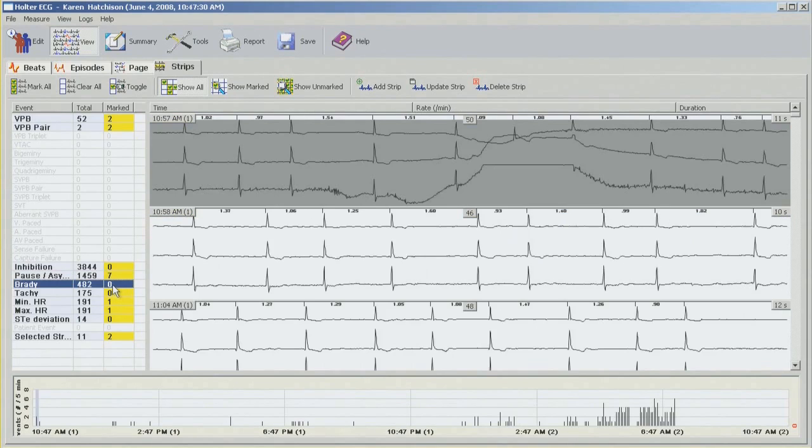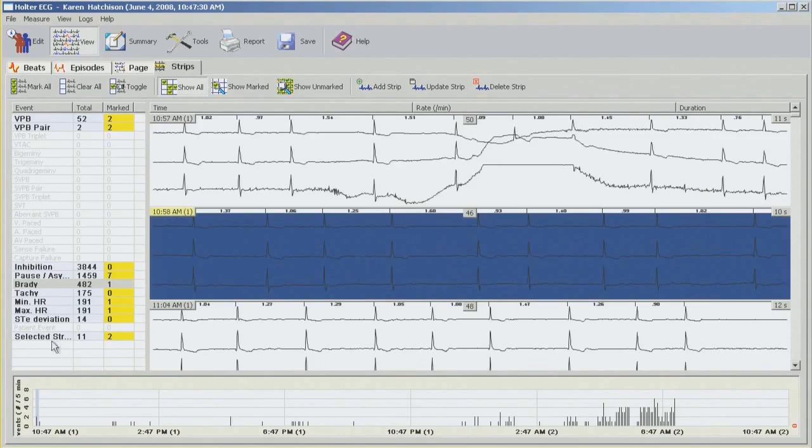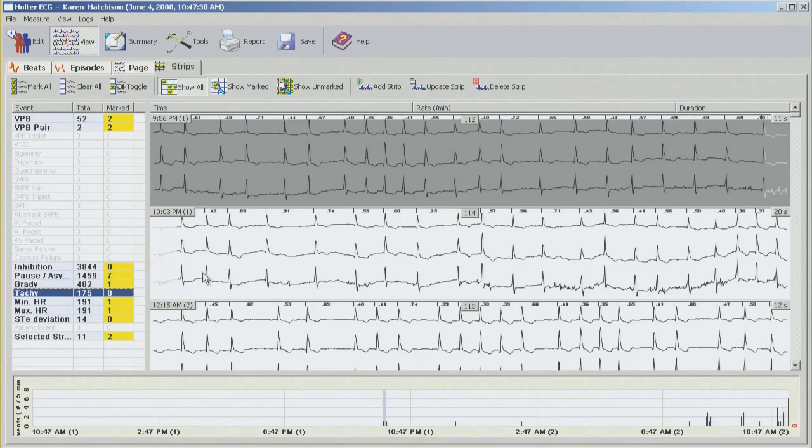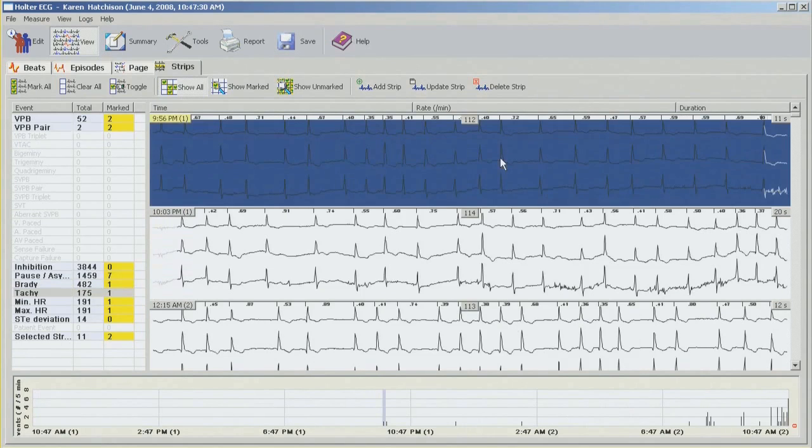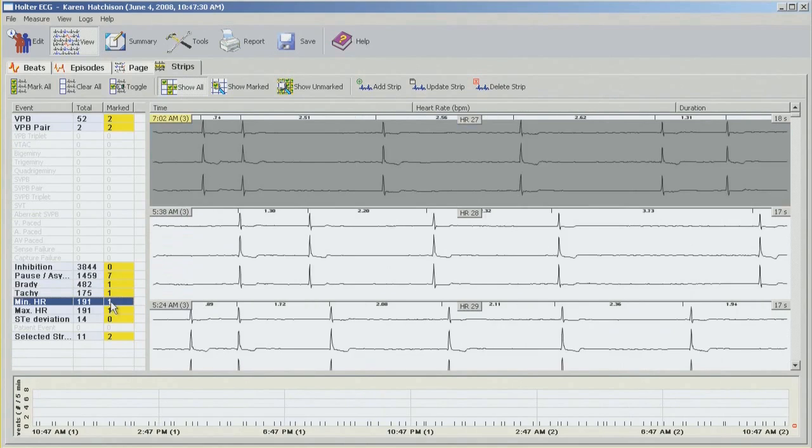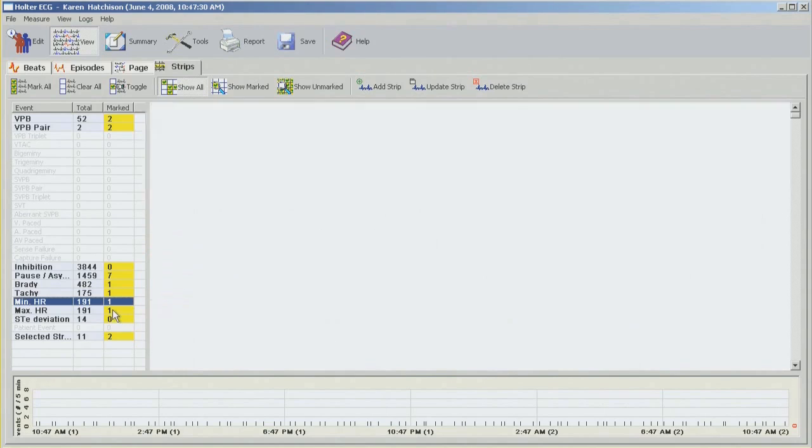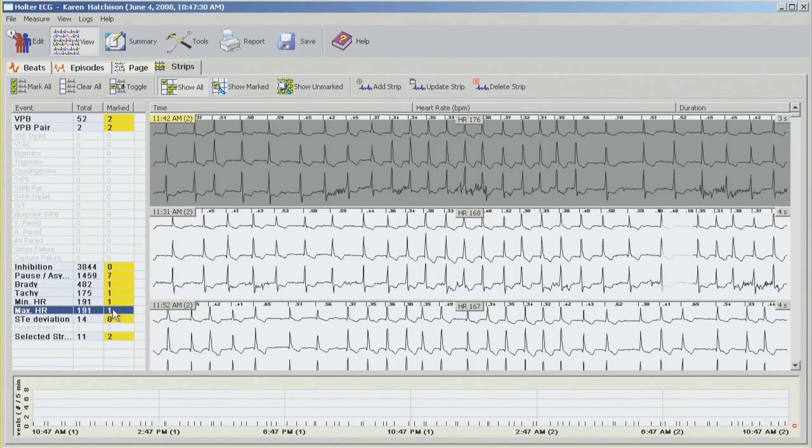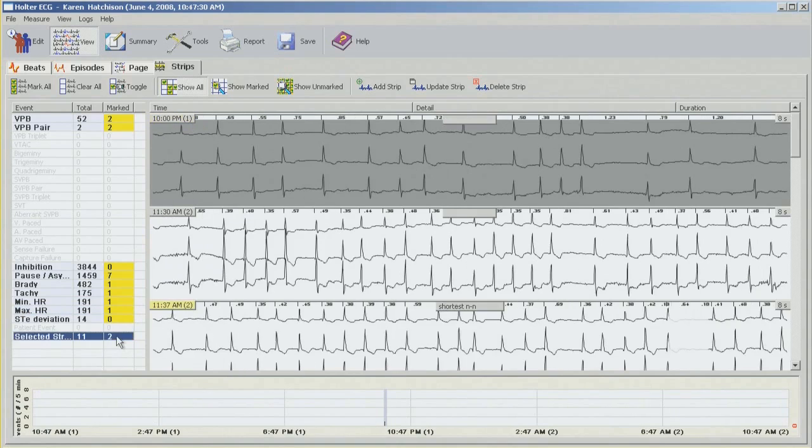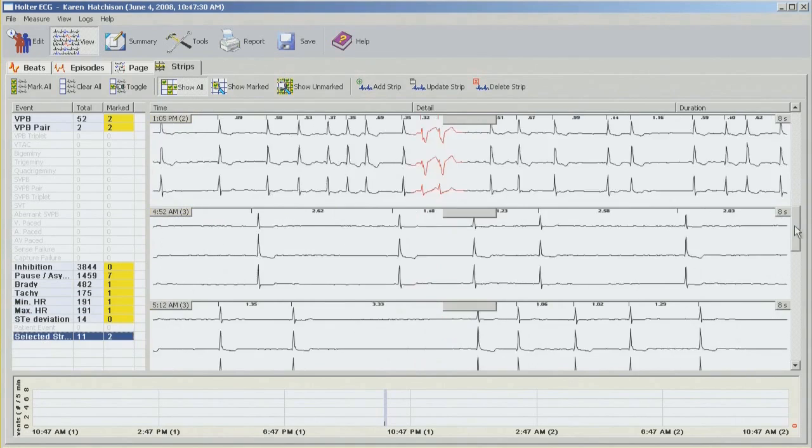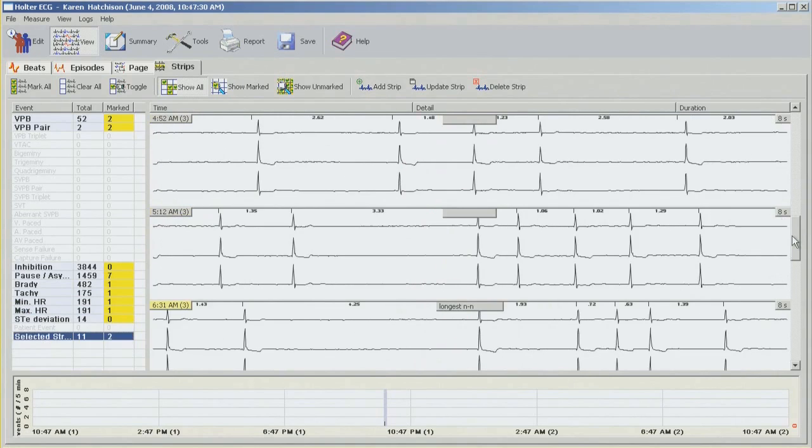I don't need any of these. Going into your pauses, 1459, five of these are already selected. And we do have the longest one already selected by ourselves. So I think this is the second longest. Bradycardia episodes. Again, maybe select one of them. Tachycardia. Minimum heart rate, 27 beats per minute. This is correct. So I'm happy with that. Maximum heart rate, 176. So we're going to leave it like this. And selected strips. So these are the strips which I picked myself. Shortest NN and longest NN. So at this point all the editing is done.